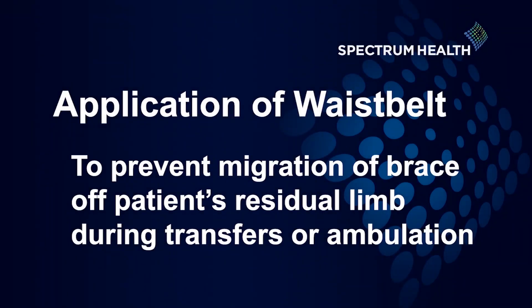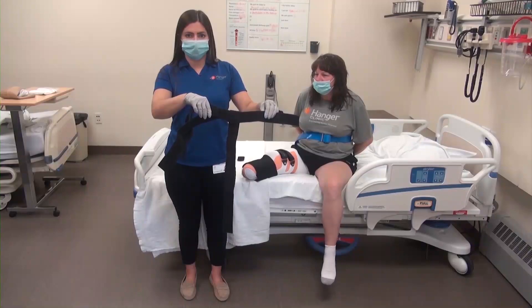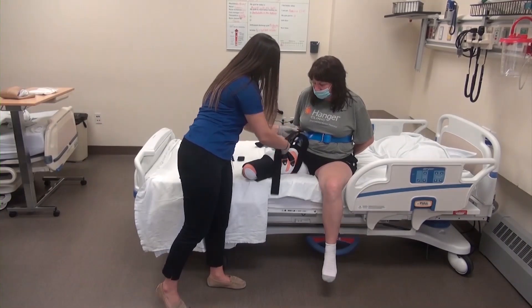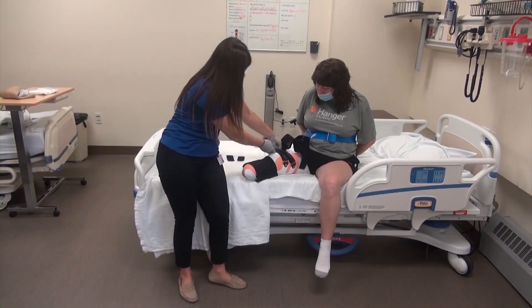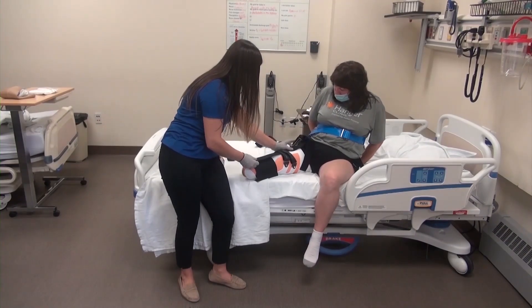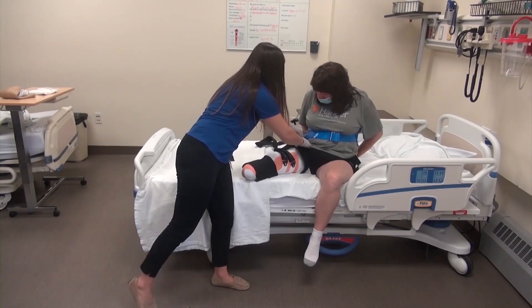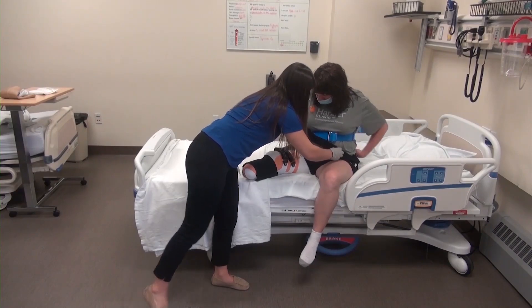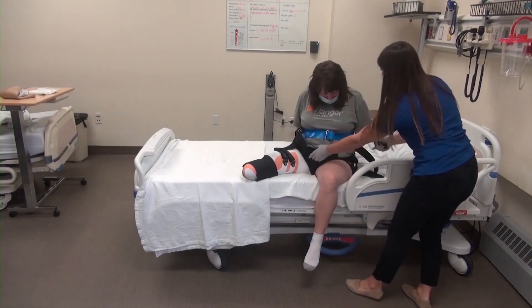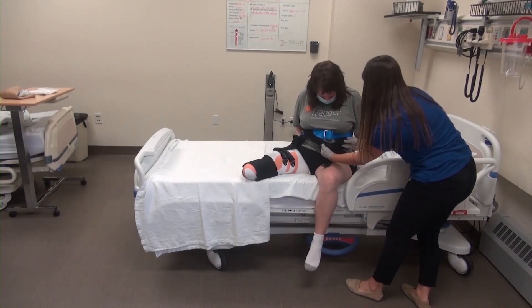When the patient is up with therapy or moving about the room for transfers or to use the bathroom, additional suspension of the device will most likely be necessary. A waist belt will be provided to the patient for this reason. To apply, the waist belt bottom strap is threaded through the top X-pattern straps and velcroed to itself. From there, the waist belt will velcro around the patient's waist to better secure the device. The excess straps may be trimmed for proper fit, adjusting the velcro based on the patient's size and length of residual limb.